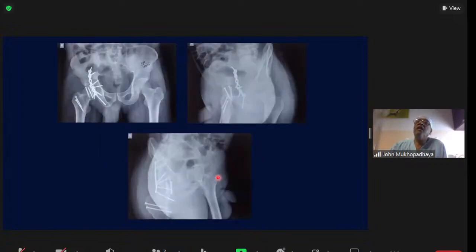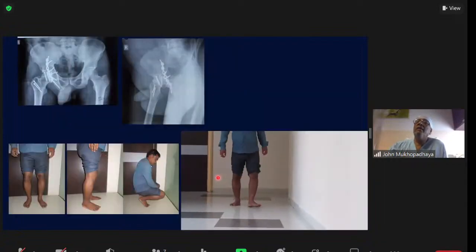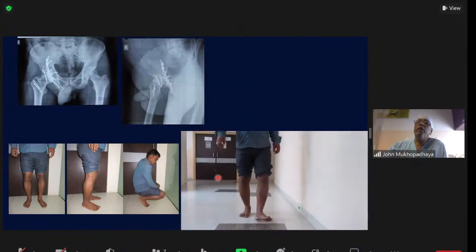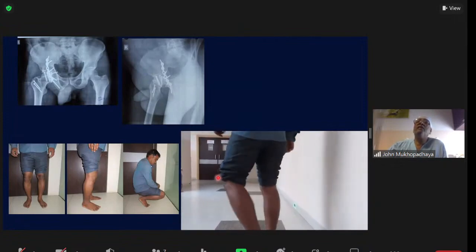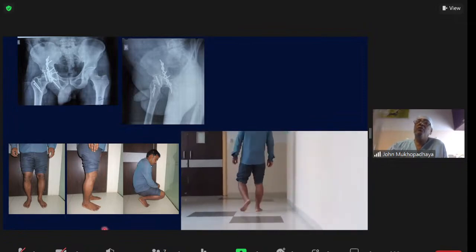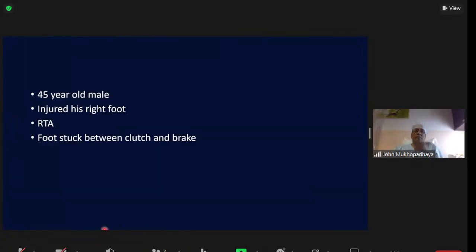Anyway, so those are the other views, the obturator and iliac views, again showing a good reduction. And this is a follow-up at about 3 years. He's still doing quite well, but if you look very closely at the x-rays, there are some signs that there is likely to be AVN. But he has lasted now for almost 4 years, I think. He hasn't come back for follow-up for some time. We have to try and get him to see him again sometime to know how he's doing now.